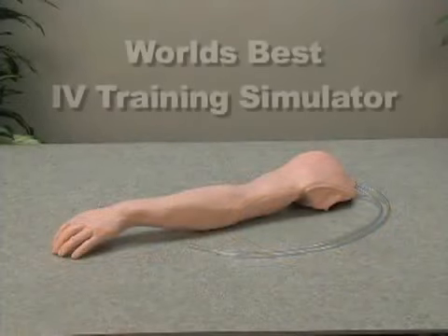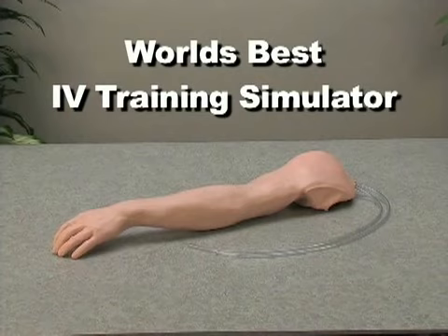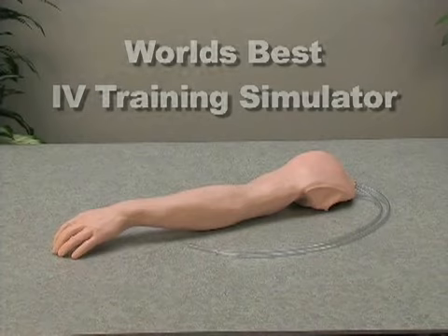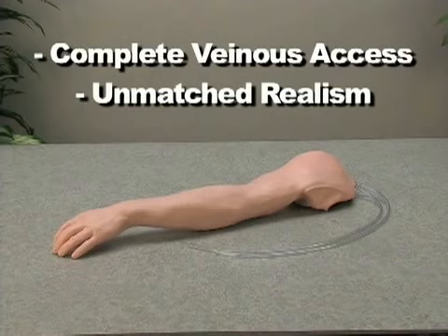The Nasco Lifeform Advanced Venipuncture and Injection Arm is the best IV trainer in the world and one of Nasco's top-selling products. The arm's combination of complete venous access and unmatched realism makes it an amazing tool in your training curriculum.